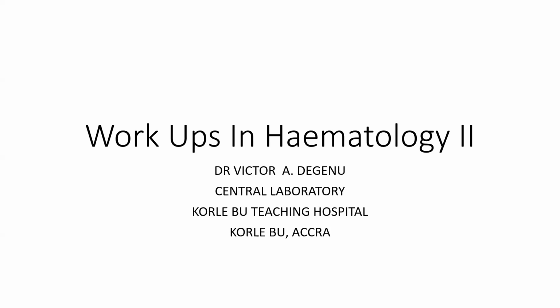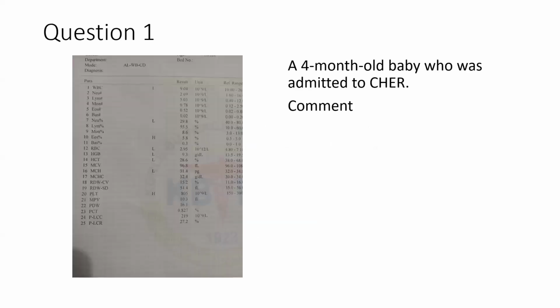I've chosen a few FBCs for which we have to comment and see whether what we are doing is right and we are getting the needed knowledge to be applied. So first thing, let's look at this one. We'll look at the full blood count.